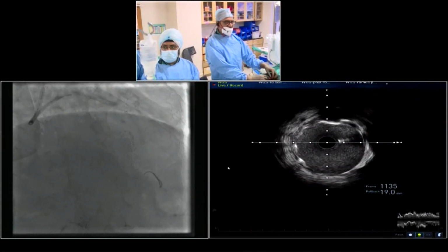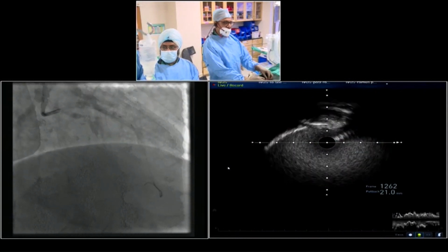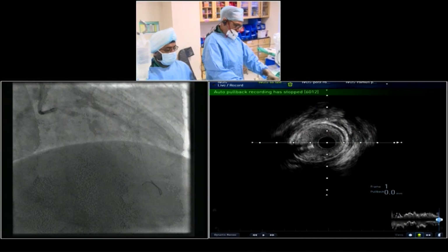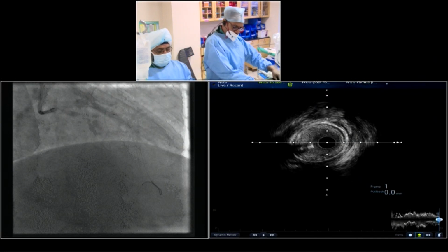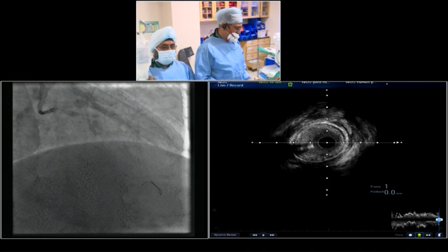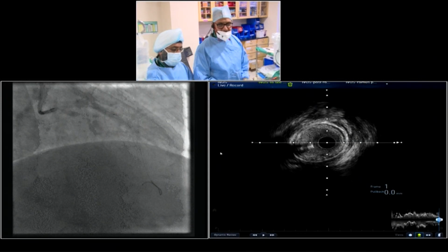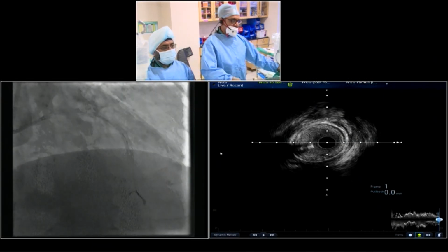Perfect position. So Srinivas, I have a question for you. Every single one of the cases live has had some imaging used. Is this standard or is this just for transmissions? Oh, no, it's not like that. Left main, I think we should appreciate that a significant number of centers are using imaging, but not for all other vessels. We have seen that in complex cases, left main more commonly, everybody used imaging. I would say it is positively increasing, but maybe 20%.